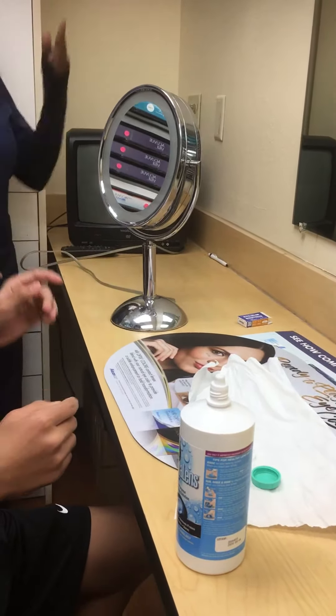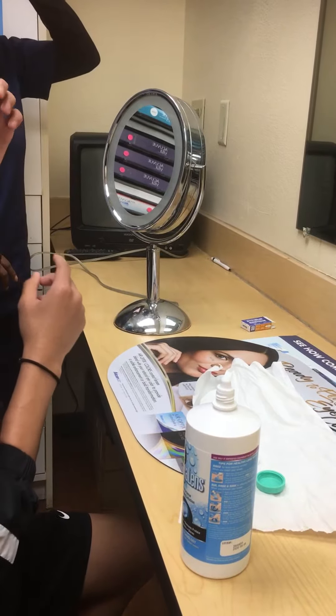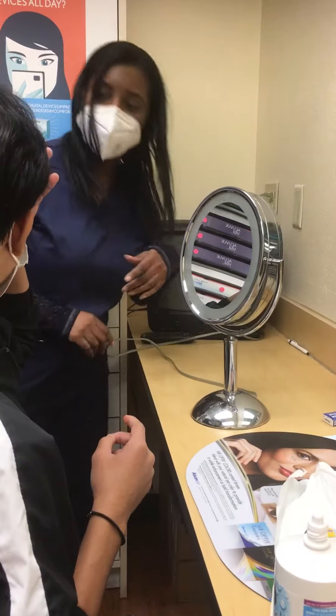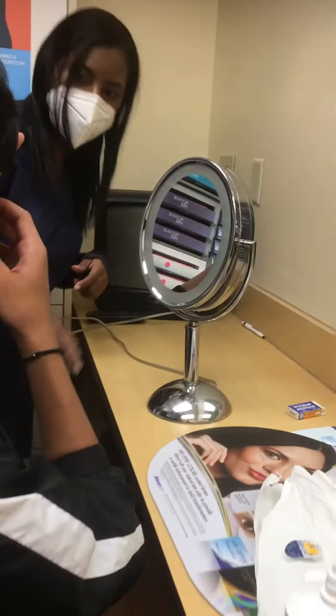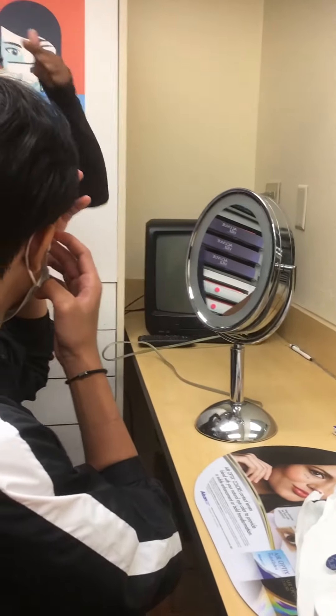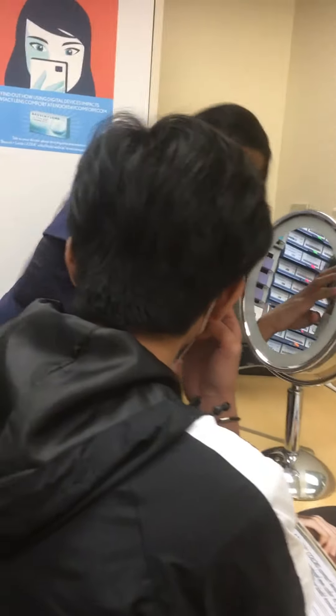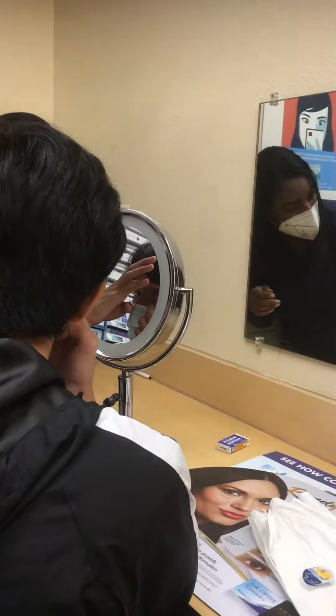Okay. So you're going to hold your top lashes with your left hand first. So hold the top lid up. Like this? Yeah, and then you're going to hold the bottom lid down with your middle finger, this one. Then you're going to use your fingers to bring the contact down — the index finger. To bring it down, and you're going to pull it out with your thumb and index finger.